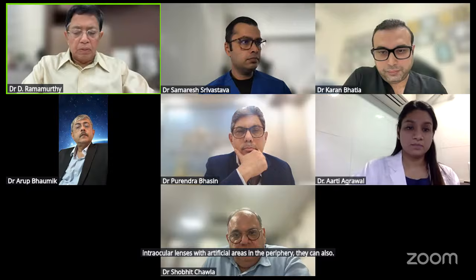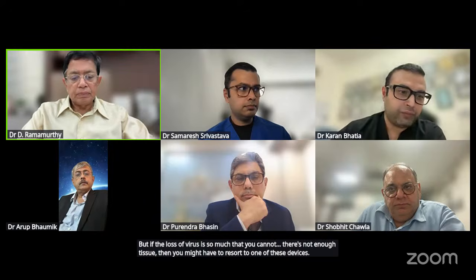But one of the problems with these is that sometimes over time they leach pigment, and they can lead to glaucoma, uveitis, etc. So if it's possible to do a pupilloplasty itself, that would be the preferred mode. But if the loss of iris is so much that there's not enough iris tissue, then you might have to resort to one of these devices. Any experience with the artificial pupils? Have you used it, sir?